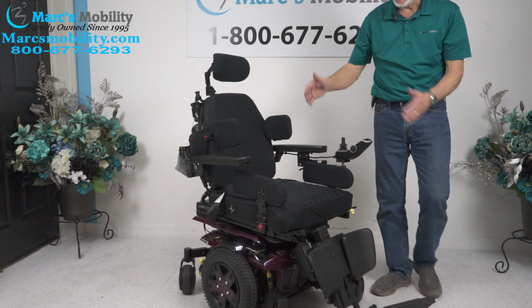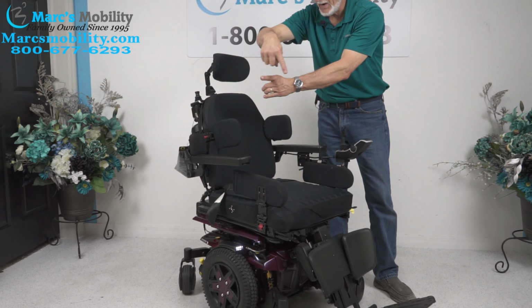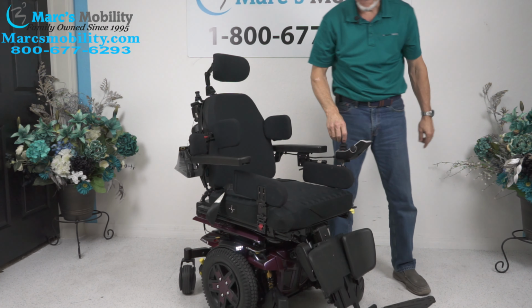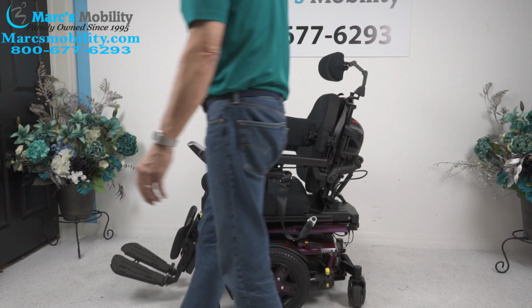Now this chair is a mid-wheel drive, so your motors are in the middle. That means the chair will turn around its own axle, okay? Best, you can see right there. If you watch the chair, it will not move from that spot.